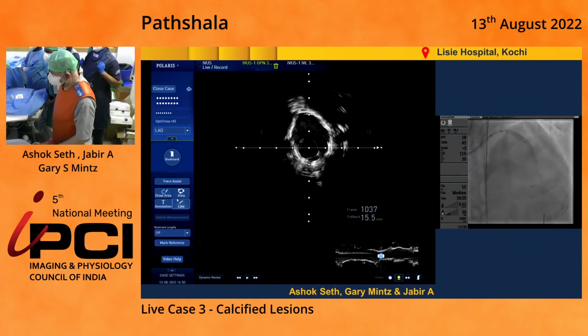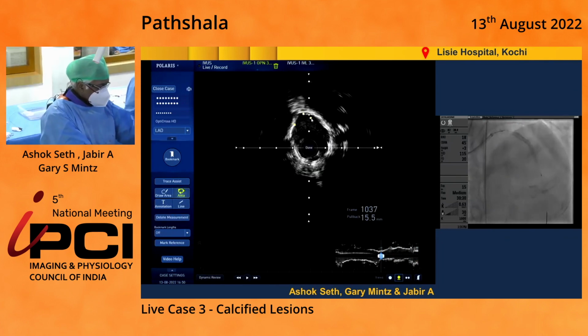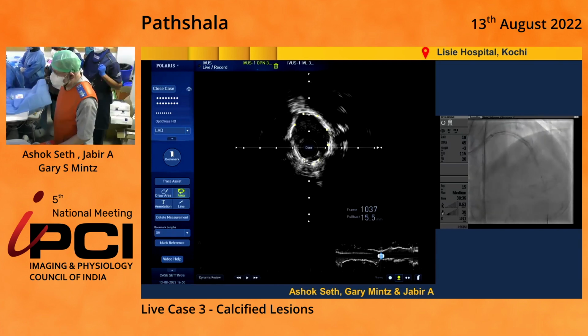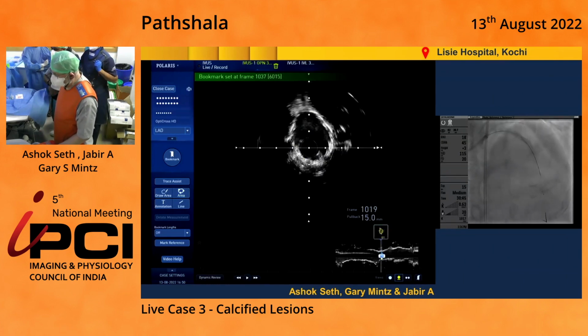Or is it calcium? Possible, or a combination. The calcium thickness here, Ziad, is impressive. Angiographically, it looked like there was a stent before they even stented it. So we probably gained a square millimeter.